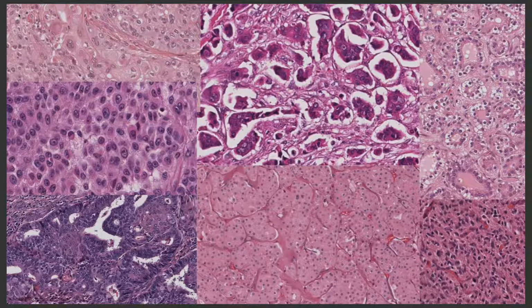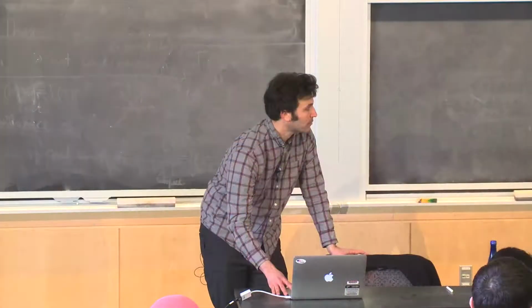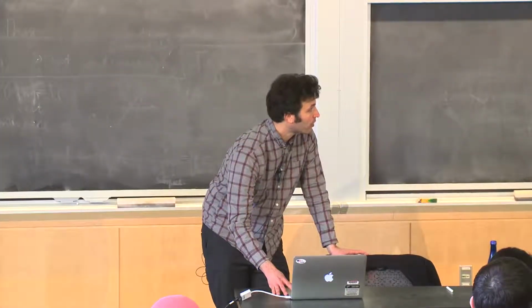Then there's a lot of patterns of disease. And these are all different subtypes of disease that all have different morphologies. So there's an incredible wealth of different visual imagery that the pathologist has to incorporate into their diagnosis. And then on top of that, there are things like special stains that can stain for specific organisms, for infectious disease, or specific patterns of protein expression for subtyping disease based on expression of drug targets. And this even more increases the complexity of the work.